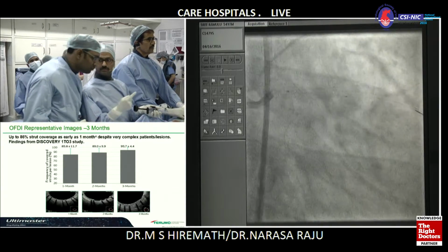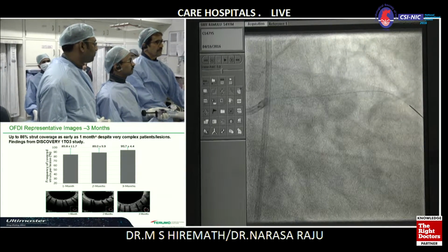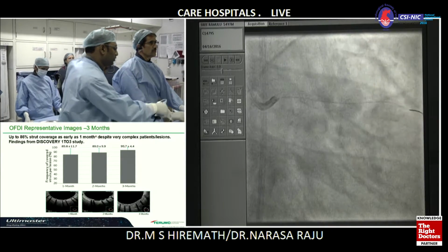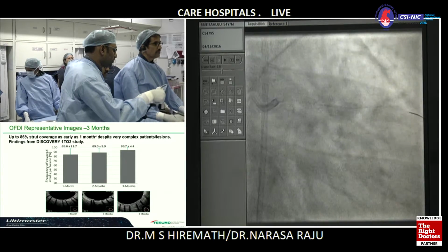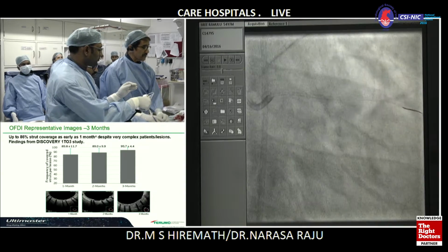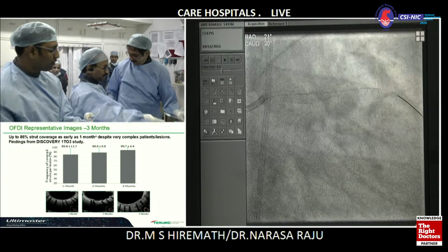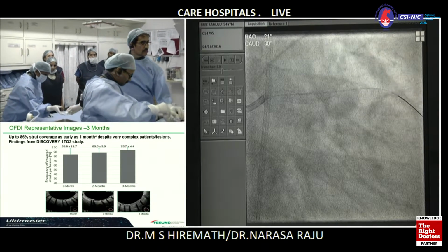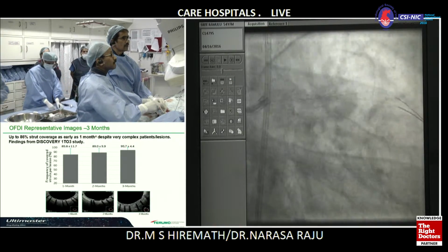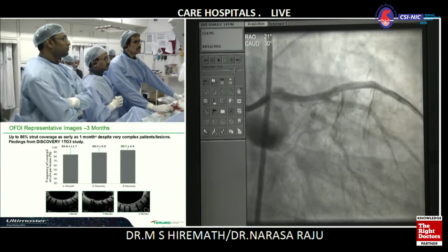We have stent boost. Oh, we'll do it later. Will you be able to show the stent boost or no? It's difficult to show them. So we'll take a picture at this stage. Good size.